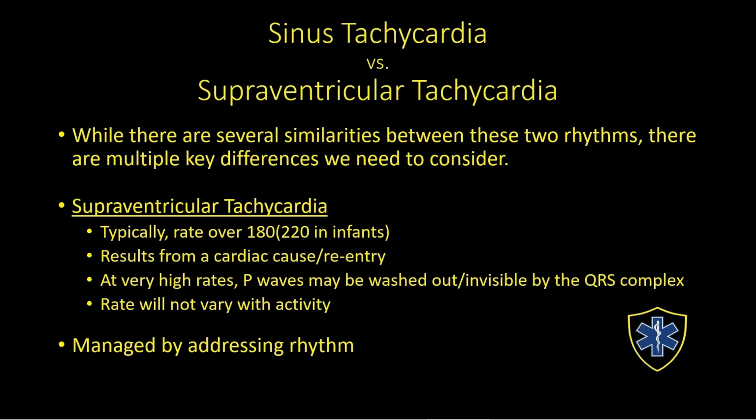Another thing interesting to note as we're discussing supraventricular tachycardia, or SVT, it has an interesting brother. Now its brother is PSVT, or paroxysmal supraventricular tachycardia. Yeah, I know, say that 3 times fast.